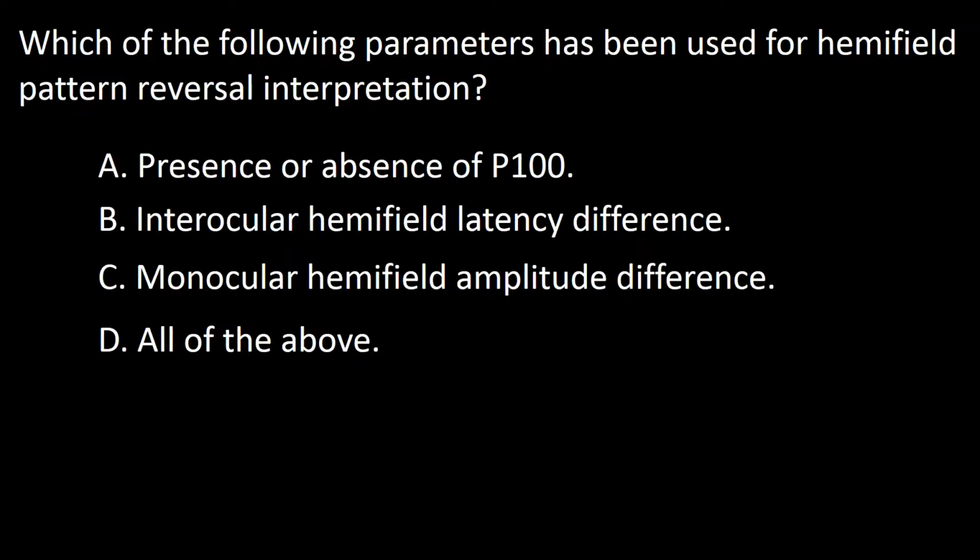Next question. Which of the following parameters has been used for hemifield pattern reversal interpretation? A. Presence or absence of P100. B. Interocular hemifield latency difference. C. Monocular hemifield amplitude difference. D. All of the above.